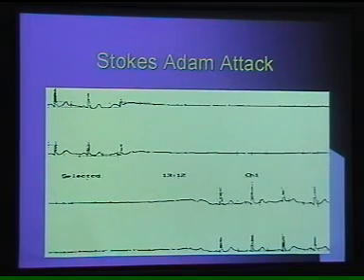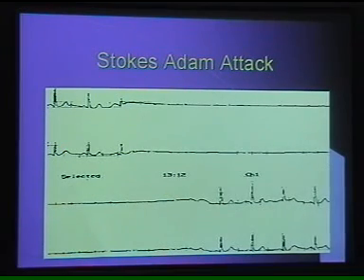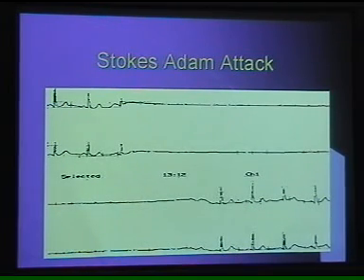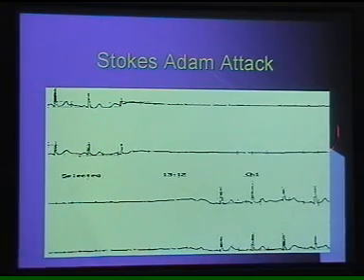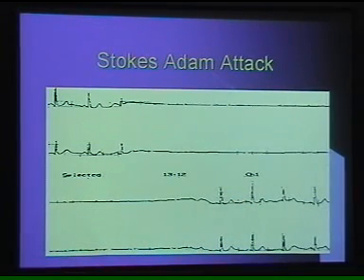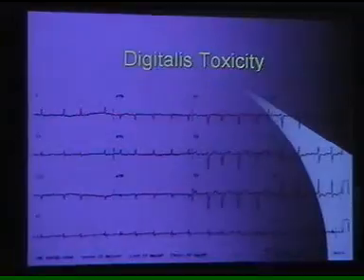Here it is the abnormality in the impulse formation, resulting in a sinoatrial block or sinoatrial arrest. The sinus stops producing the impulses, and there are long pauses of silence, and that is the time, if the heartbeat doesn't resume or is not treated, that can result in sudden cardiac death. Next one.